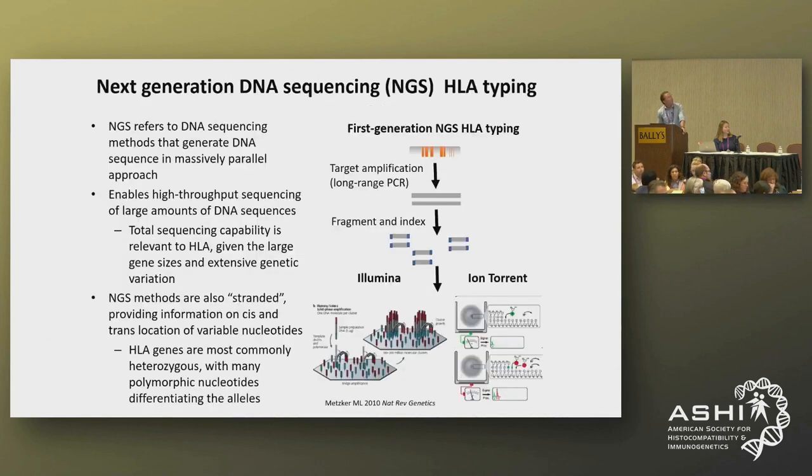So, getting to next generation DNA sequencing: NGS simply refers to DNA sequencing methods that generate DNA sequence in a massively parallel approach. There are two main applications within the clinical space.